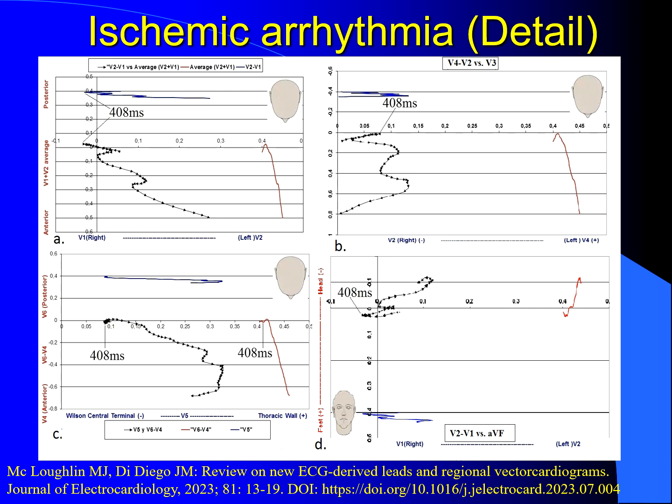While in the frontal plane, panel D, there is a U-turn with the normal part slightly more caudal than the abnormal. It should be noted that when the observation point changes from panel A to panel B, a specular inversion of the tracing is produced.